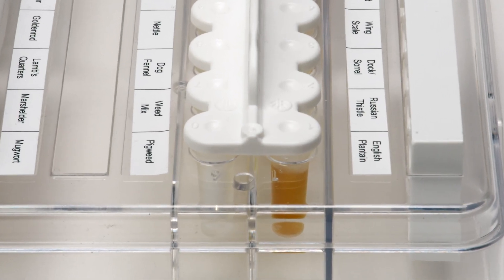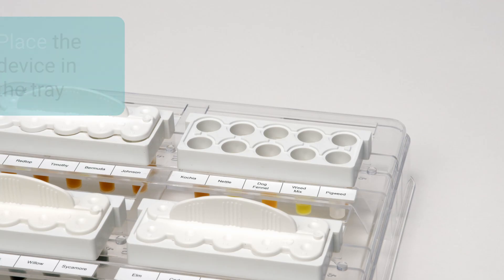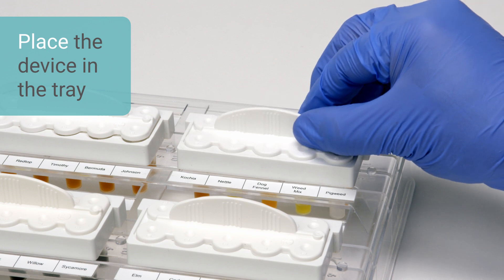Ensure the small indented circle on the Comforten device is pointing towards the orientation spot on the tray. Then place the tips in the pre-filled reservoirs.